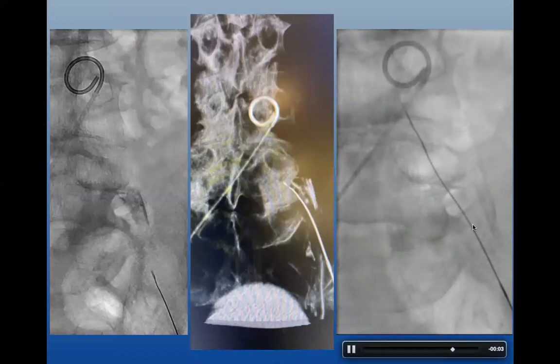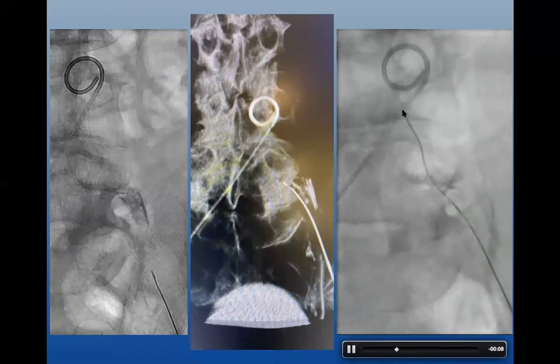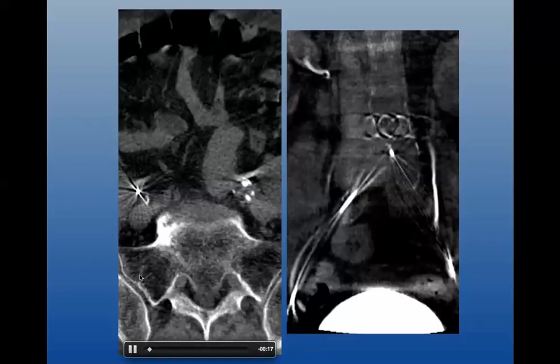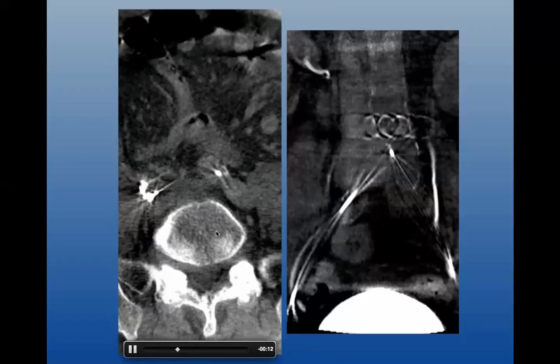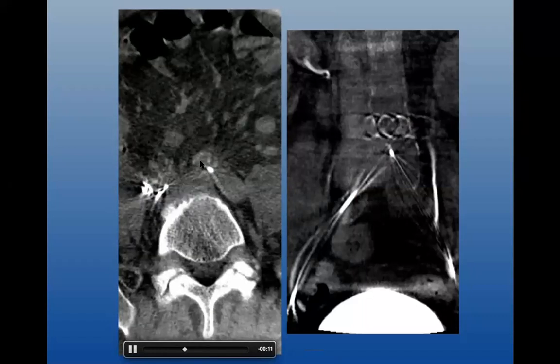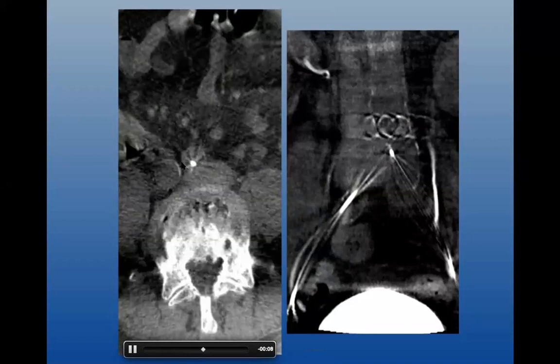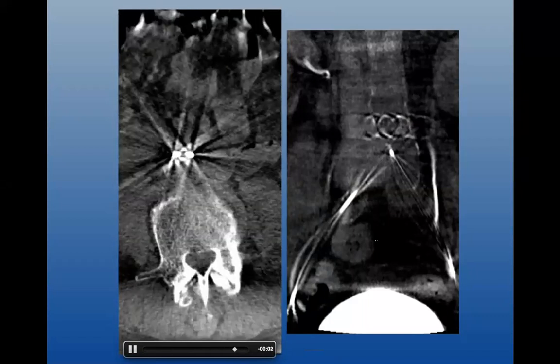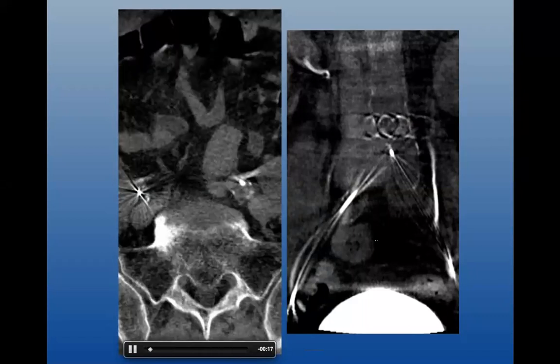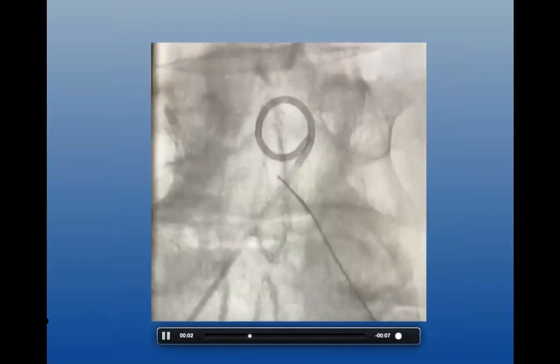And I knew which direction I had to go, whether it was anterior, superior, lateral, medial, and I was able to get to here. And once I got to this spot, I again did another cone beam CT, and you'll see this. Here's our catheter, and you can see that now I am within this vessel all the way, and you'll see it joining the right side, and I'm right at the crotch of the distal abdominal aorta. And you can see here on the reconstruction. So now I knew that I'm in a favorable place. And this is really what it looks like when you're recanalizing a CTO.